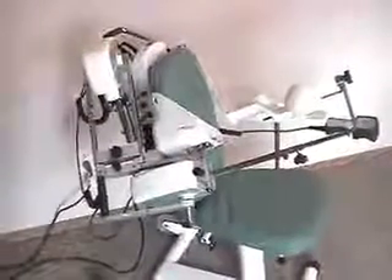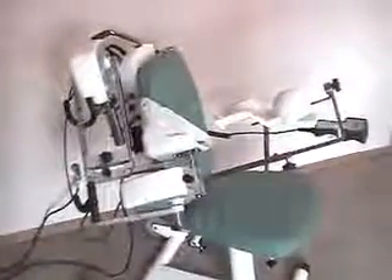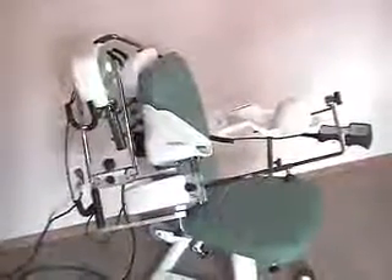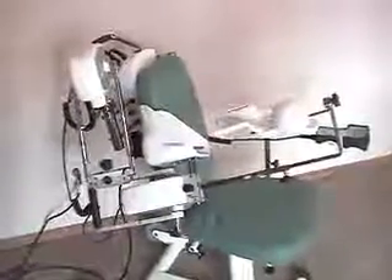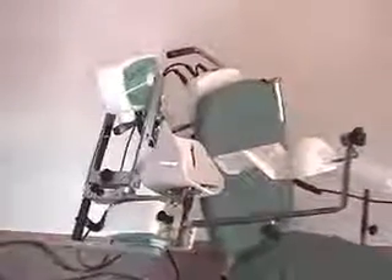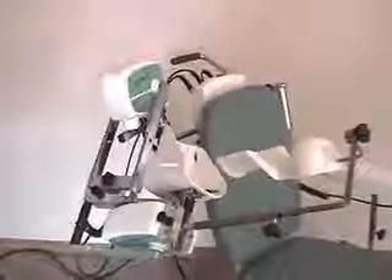Here we have the abduction and adduction with associated rotation splint setup. However, in this case we are only doing abduction and adduction at the moment. If you'll notice, only the first motor, M1, has any motion going on.